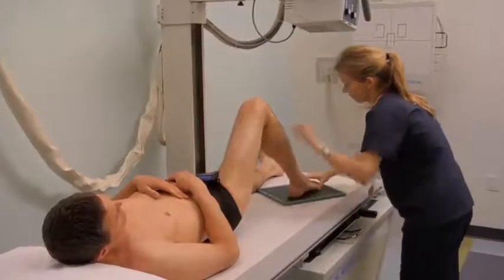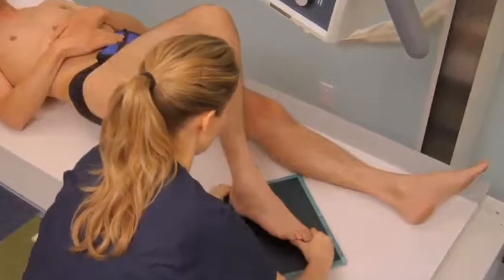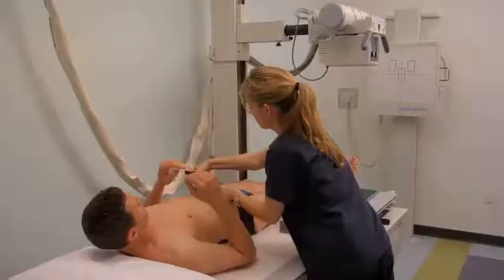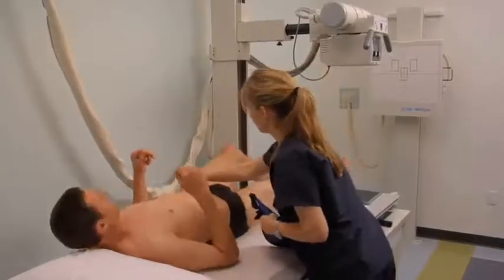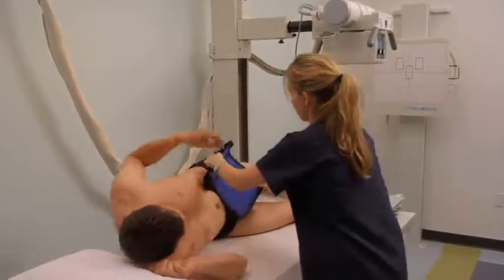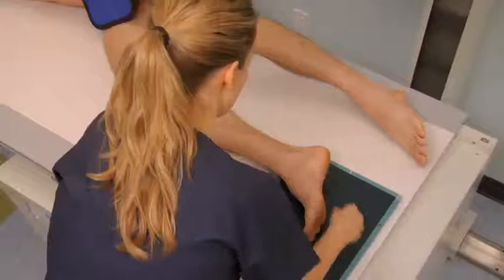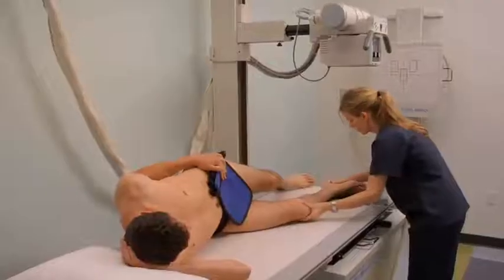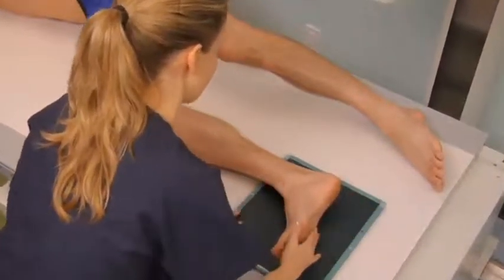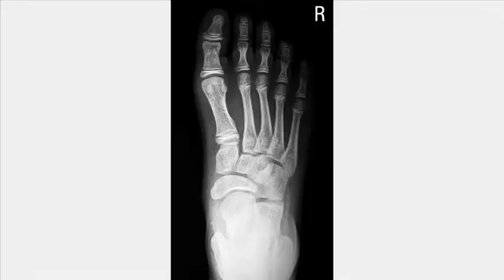For an AP oblique projection of the foot, rotate the leg and foot medially until the plantar aspect of the foot is 30 to 40 degrees to the plane of the cassette. Direct the central ray to the base of the third metatarsal. To obtain a lateral or medial lateral projection of the foot, ask the patient to rotate their entire body towards the affected side. Flex the knee of the same side to 45 degrees. Align the foot with the center of the cassette and direct the central ray as before. Instruct the patient to extend their opposite leg behind the affected limb and ask the patient to dorsiflex their foot to 90 degrees. Expose, process accordingly, and review the images obtained.